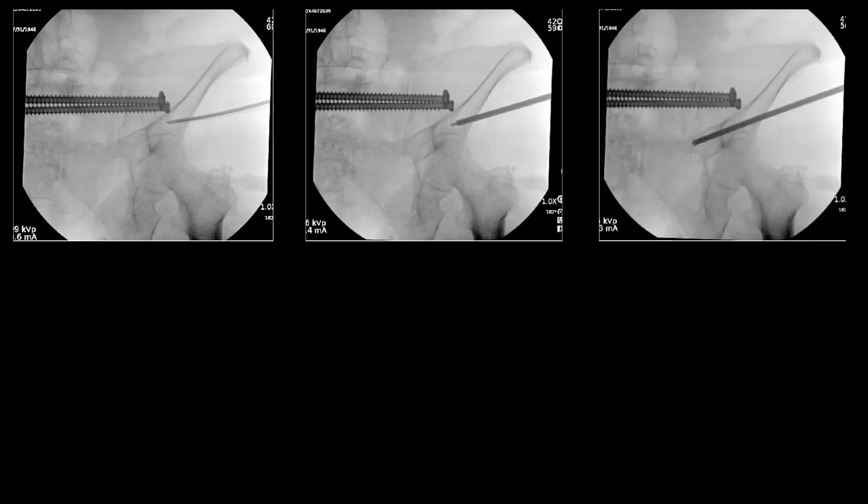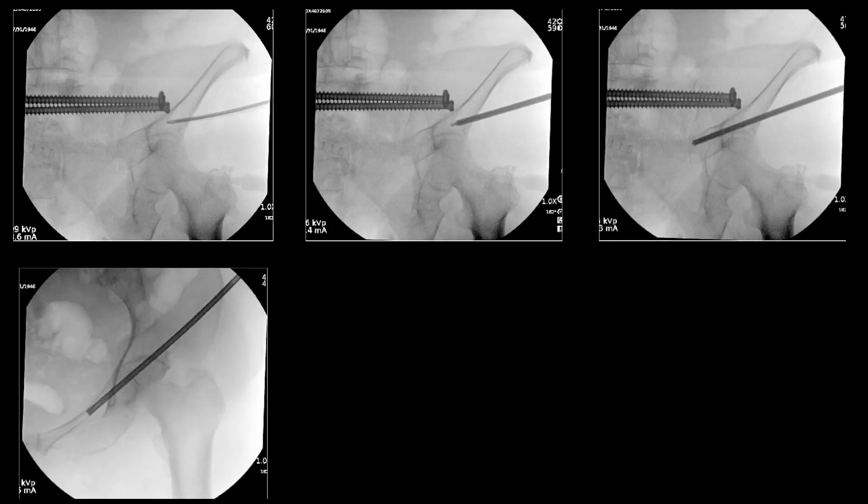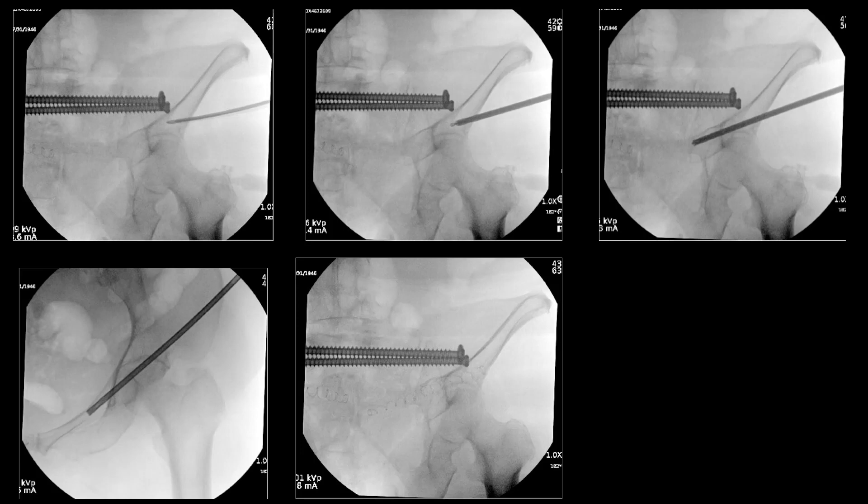For the other side where we had that small undisplaced pubic rami fracture, we went anterograde using a similar technique — orienting and getting started with the guide wire, adjusting orientation with the drill bit, and getting past the hip joint down into the rami. The rami is really thin in this population; a lot of these patients are elderly females and they tend to have very narrow rami. This is another area where Luminos is advantageous, because getting a straight screw down this very small intramedullary canal can be quite challenging, whereas the Luminos, being flexible, will contour more easily. You can then pass the flexible reamer and proceed with implant placement.